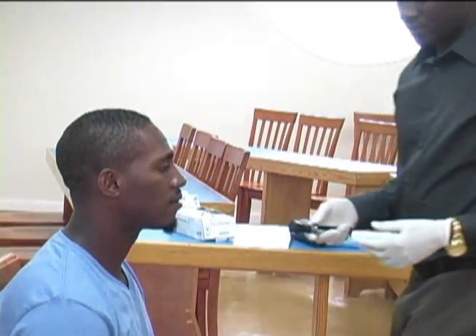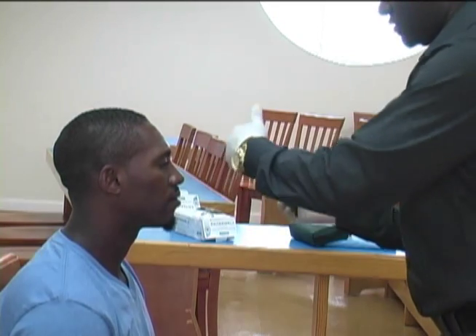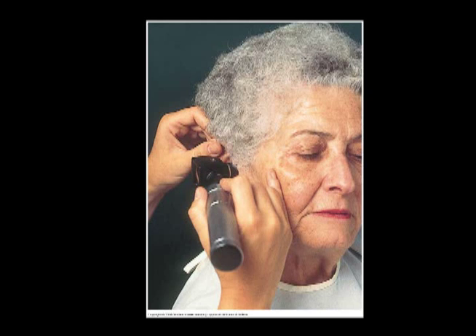Otoscopic examination. Procedure. Tilt the head to the opposite side of the ear to be examined. Straighten the auditory canal by pulling the external ear up, out, and backwards.